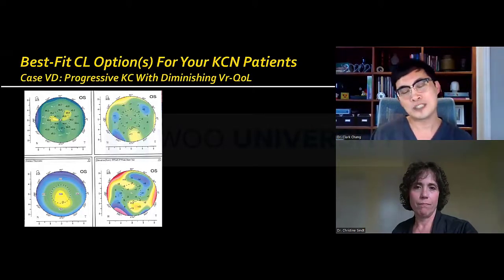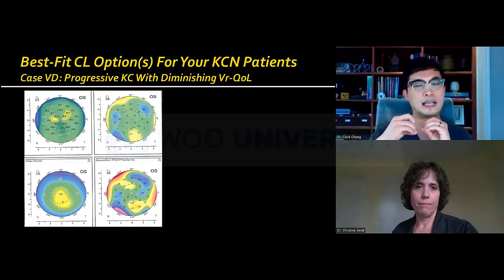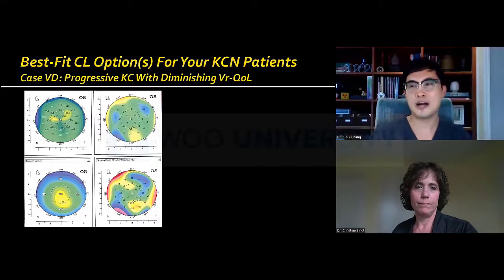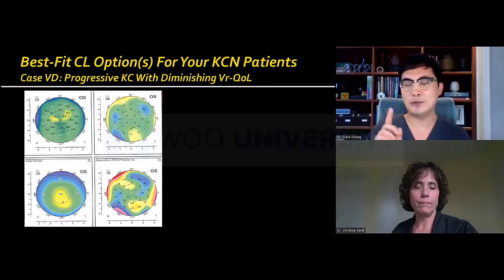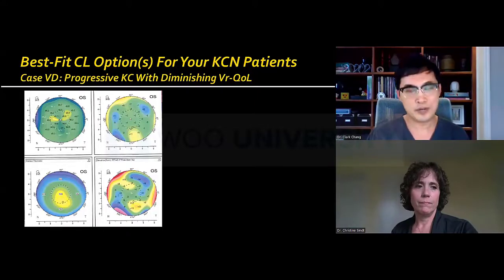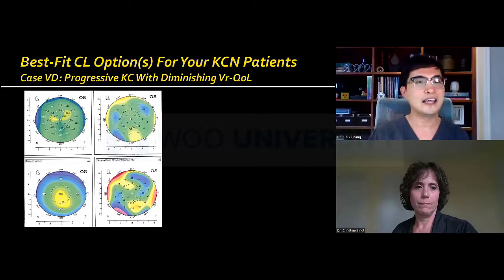And we thought, maybe you just have, and he did have, a very large baseline scotopic pupil. And so we thought, well, it could just be that you're seeing the spherical aberration at night from the marginal rays. And maybe that's what it is, because we did wavefront aberrometry. We're looking for elevation in vertical coma, and spherical aberration, to be honest, wasn't all that elevated.